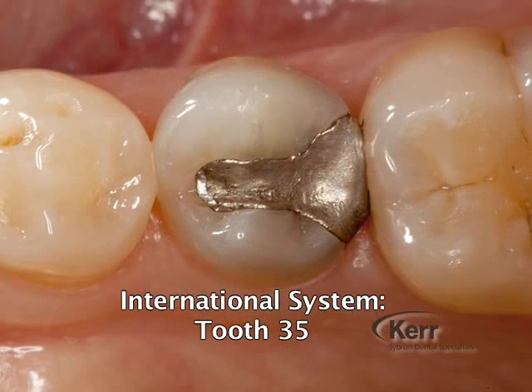Dr. Galagos has an amalgam in the lower left quadrant, tooth number 20, which he would like to have replaced with a composite. I'd just like to show my magnification system. I believe it's best to do all dentistry under magnification. These are new kinds of loupes called Revolution, and they're from Orascoptic. In the past, I've always had difficulty deciding whether to get flip-up or fixed through-the-lens type of magnification.